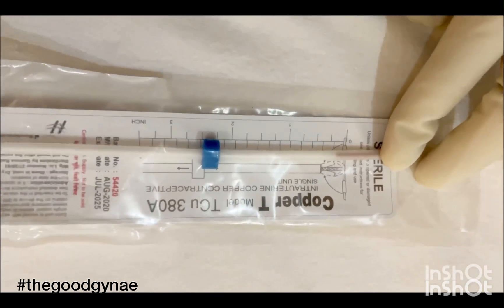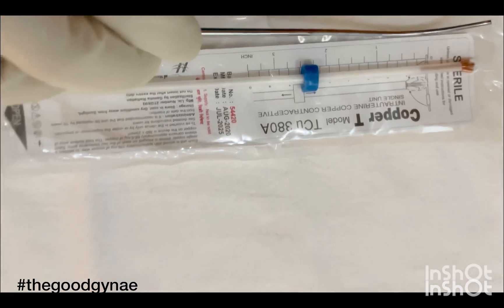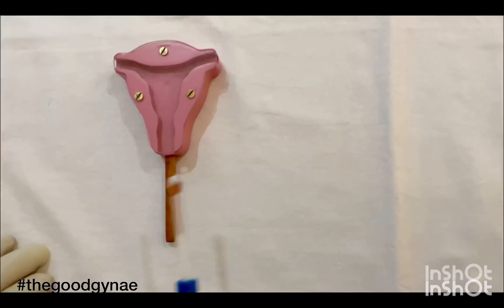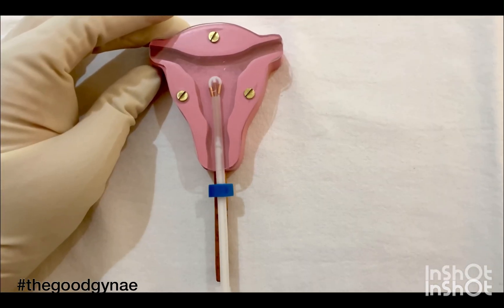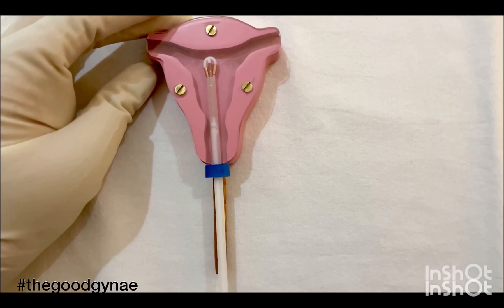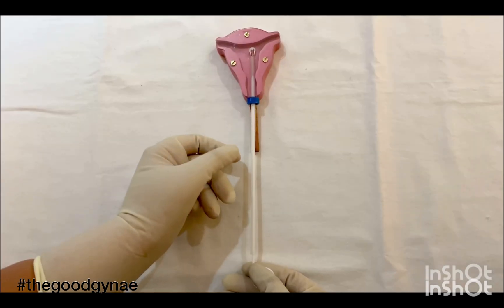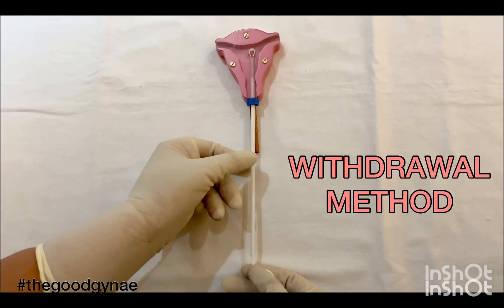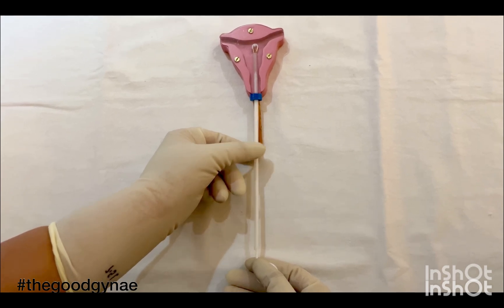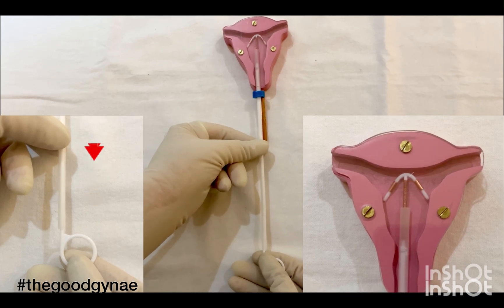Still keeping the copper T in the packet, we adjust the guard or flange according to our measured utero-cervical length. We then take the copper T and insert it inside the cervical os until the flange touches the cervix — at this point the copper T is just touching the fundus. To release the arms of the copper T, we use the withdrawal method: we retract or pull back the insertion tube without moving the rod.